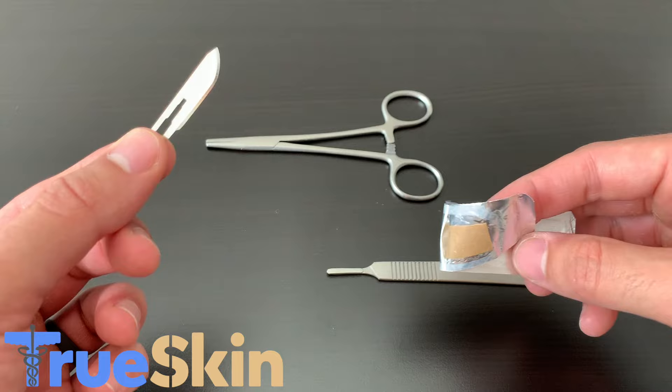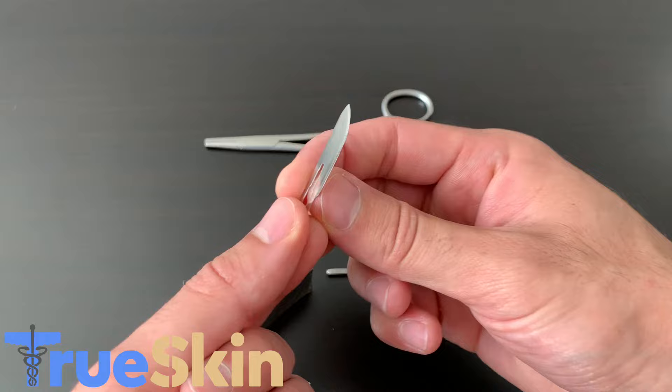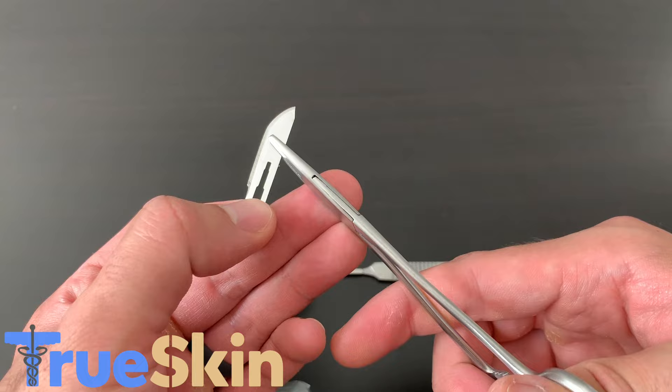You'll notice that the curved side is the sharp, active side, so we'll want to stay away from that. Rotate the active side to the left, and then with your needle holders, get a secure grip on the back side of the blade.